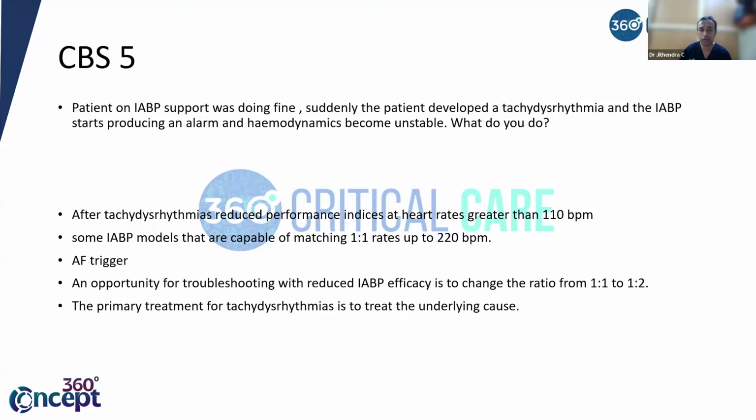Primarily you can't do anything about the IABP. The only management is that you should correct the underlying tachydysrhythmia. So start him on some antiarrhythmics or things like that. That is what will help ultimately. But for the IABP to continue to function, you change the trigger to AF trigger or put on auto mode and treat the underlying tachydysrhythmia.